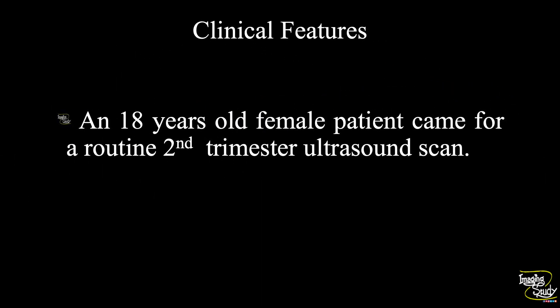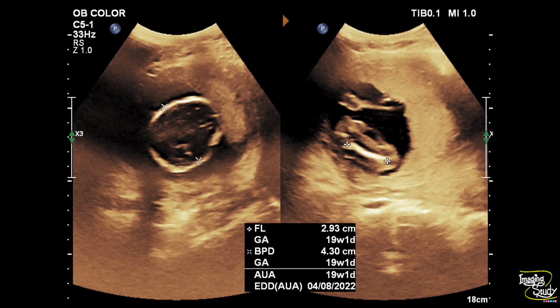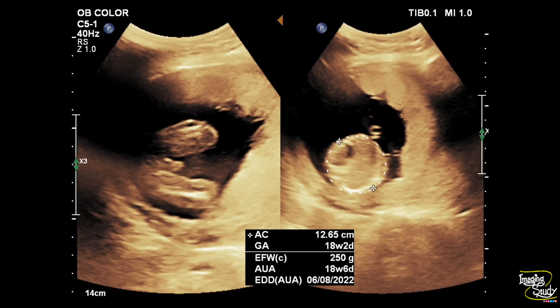An 18-year-old female patient came for a routine second trimester ultrasound scan. We have measured the gestational age according to biparietal diameter and femoral length — the gestational age is around 19 weeks, one day. We have measured the abdominal circumference also and the weight was around 250 grams, which is quite normal at this age.